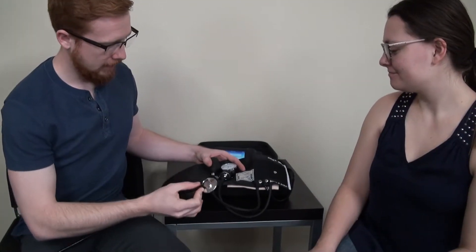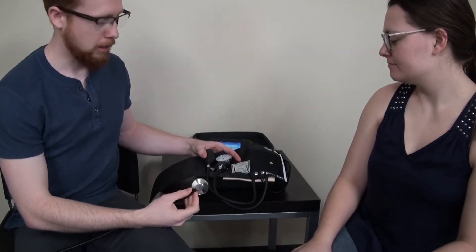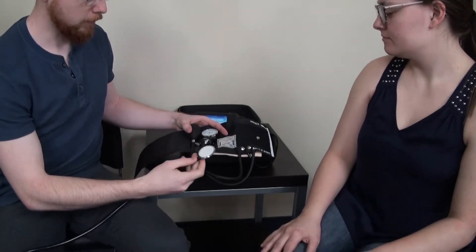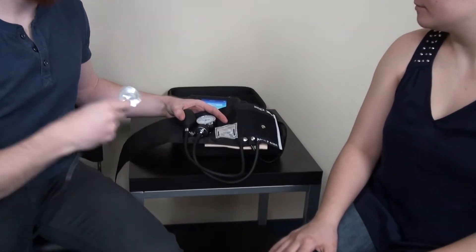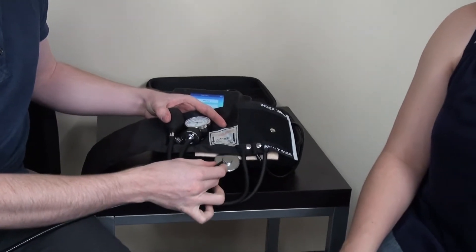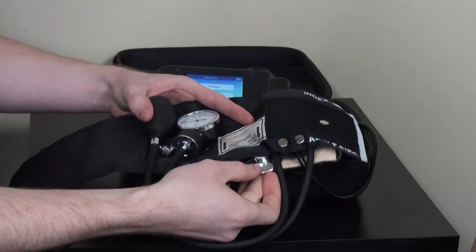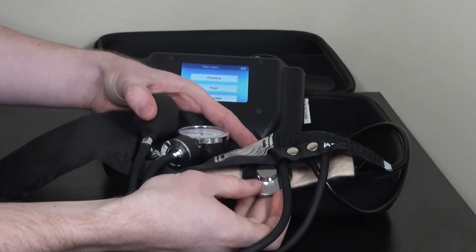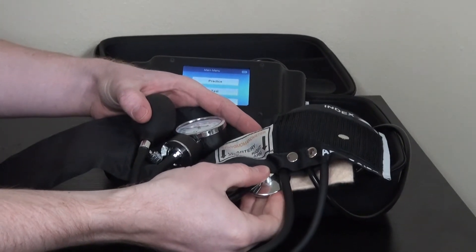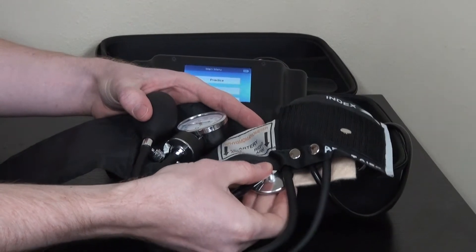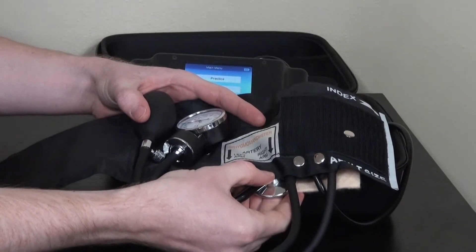We've provided a secondary skin underneath the cuff that allows for the transfer of sound into the standard stethoscope. By placing the stethoscope in the intended location over this secondary skin, we'll pick up on the five Korotkoff sounds based on the blood pressure.